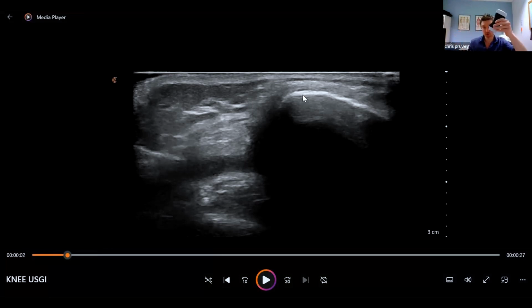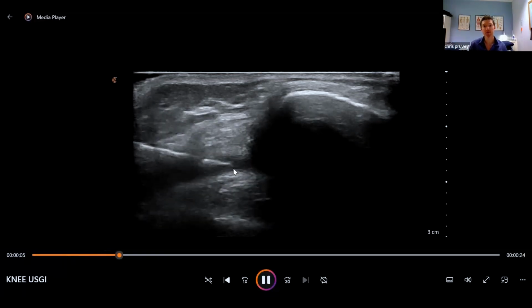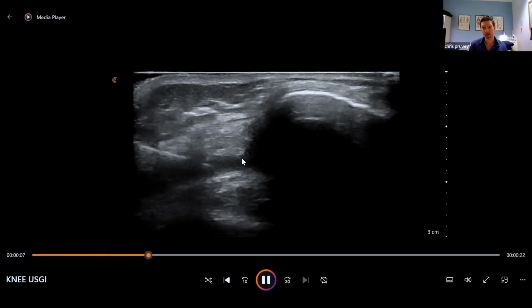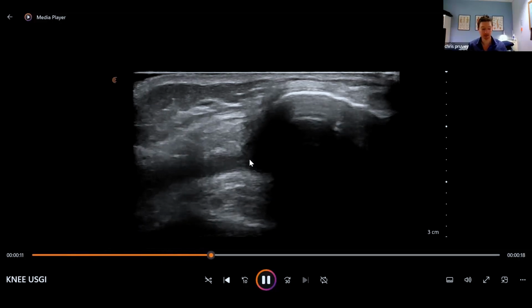This is all just joint fluid around here, and you see the needle tip coming in. This is the femur, the bottom end of your knee, the inside part of your knee, and this is the kneecap, and I've just laid it down. You'll see this is the needle tip, straight in the knee, and then you can fill it with a bit of Duralane there.